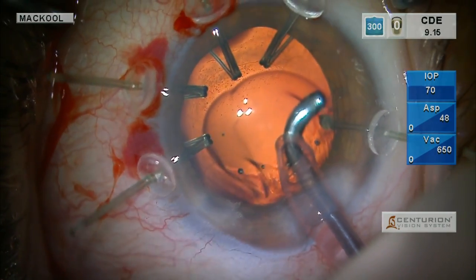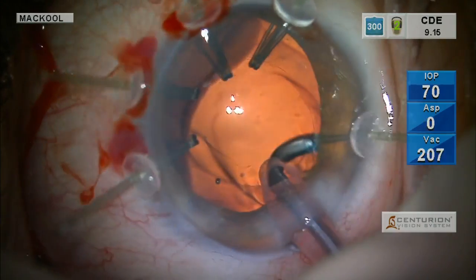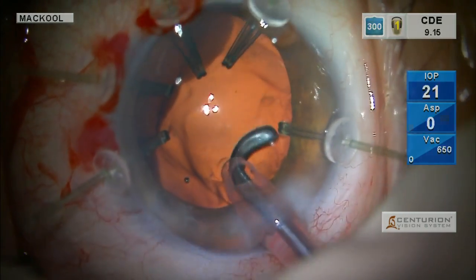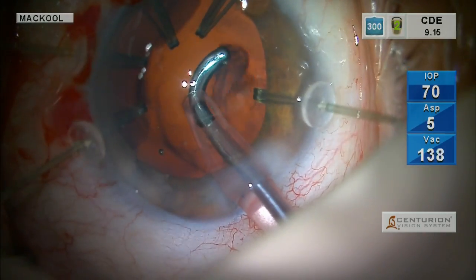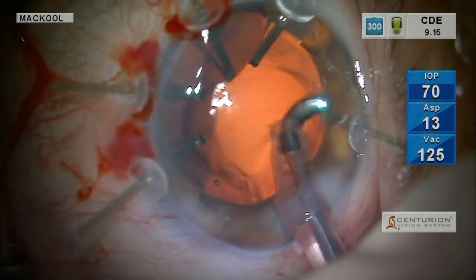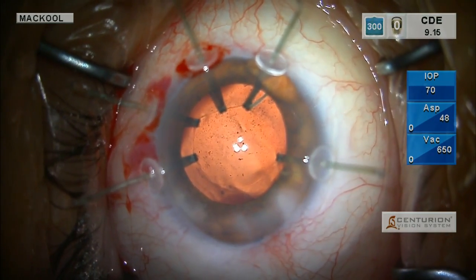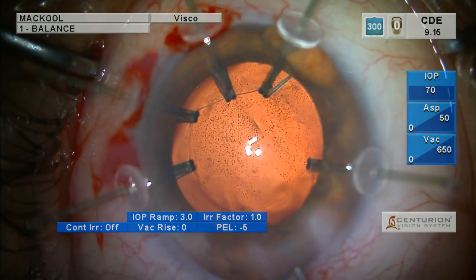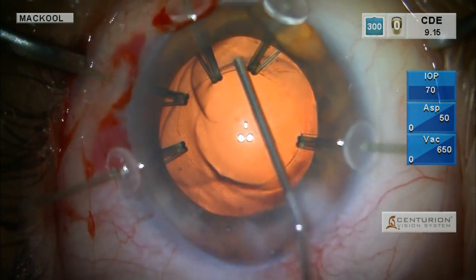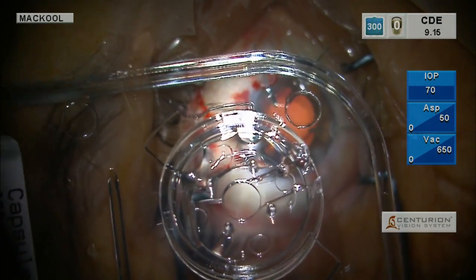Patients will often feel some pressure — the IOP setting is 70. That's not very high, but patients with a lax zonule have the posterior capsule going back more. They may feel some pulling on the remaining zonule area because of the localized force on just a few zonules to ciliary processes. The other possibility is thin sclera and poor ocular rigidity causing stretching. Regardless, cortex is gone, and we're going to put in the capsular tension ring.